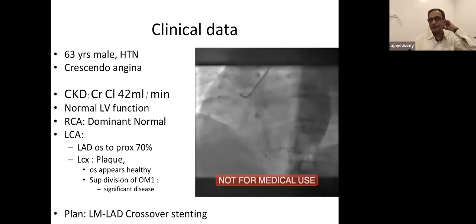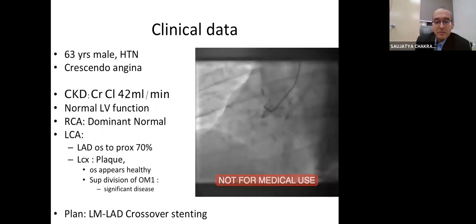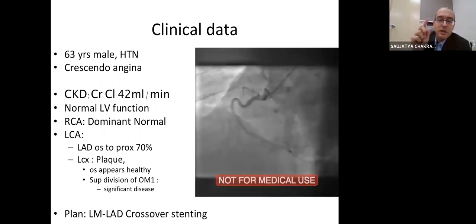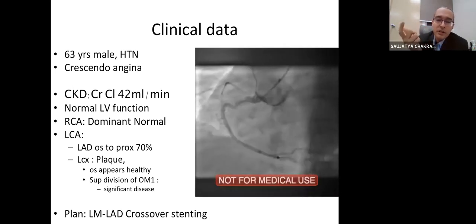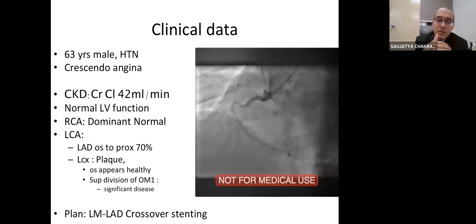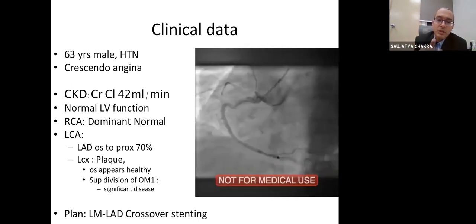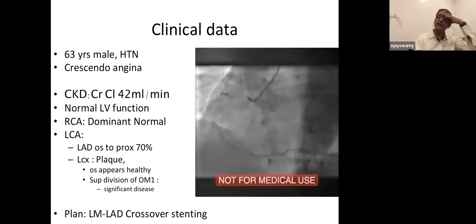Yeah, yeah. So, sir, you were mentioning that in eccentric calcium, we should do imaging and see whether the rotawire is towards the side of the nodule and not away from it. So can we be really sure that when we are actually rotablating after we have taken the imaging catheter out, the wire will still stay in the same position and not migrate to the other part?